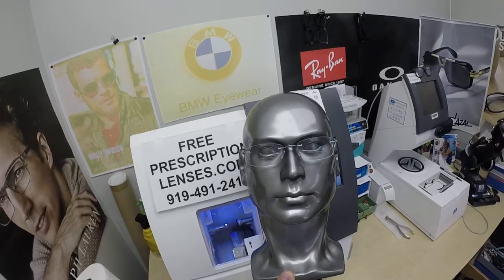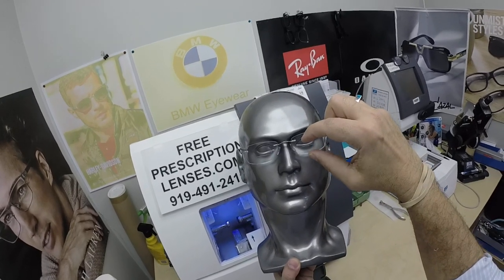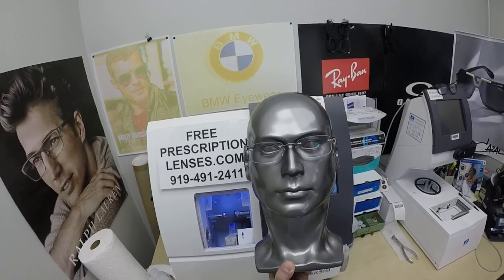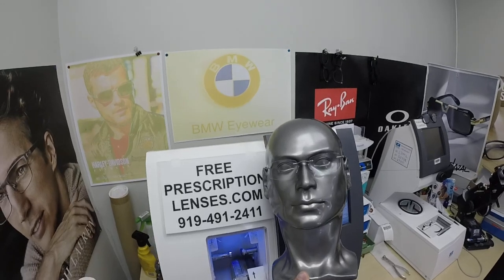The nice thing about Silhouettes is that if you tell me you like a certain shape but wish it were wider, deeper, or more narrow in any direction, I can do that. I do not have these on the website, so you'll need to call us to order one, which is what he did.